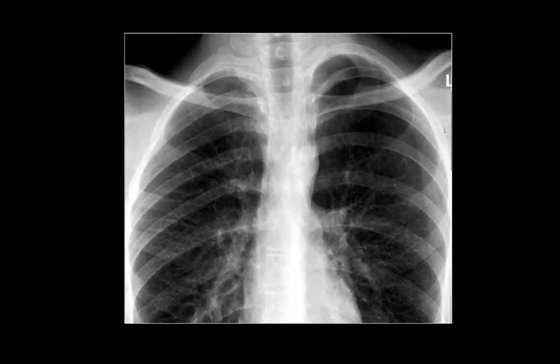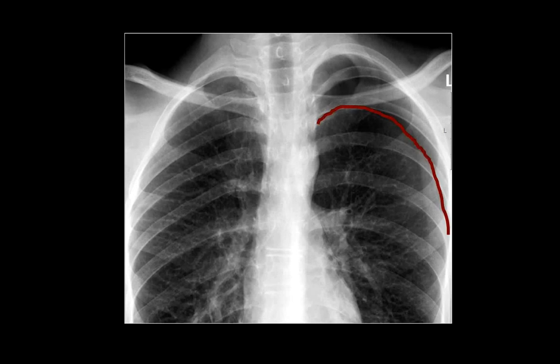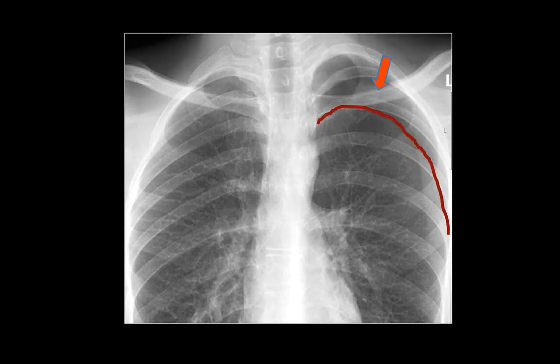If you look at the right lung, you'll notice that the lung markings reach all the way to the periphery — to the bones. However, that's not the case on the left side. The first thing you notice is a smooth thin line that displaces the lung markings inwards, which is why you don't see any lung markings at the lung apex. Both of these signs — the presence of a visceral pleural line and the absence of lung markings beyond that line — are classic signs of a pneumothorax.